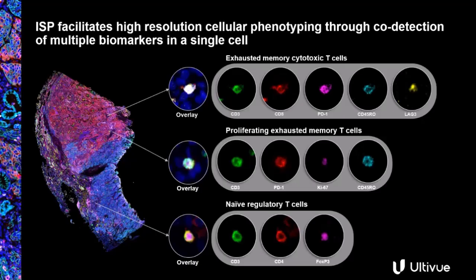It also shows that this data can become really complex. So coming from IHC, where a human reader is still key, on MIF, you really need to have computational tools to read such an image. There are millions of cells on it, with colocalizing expressions, and it's only possible via a computational approach to make sense of this complex data.